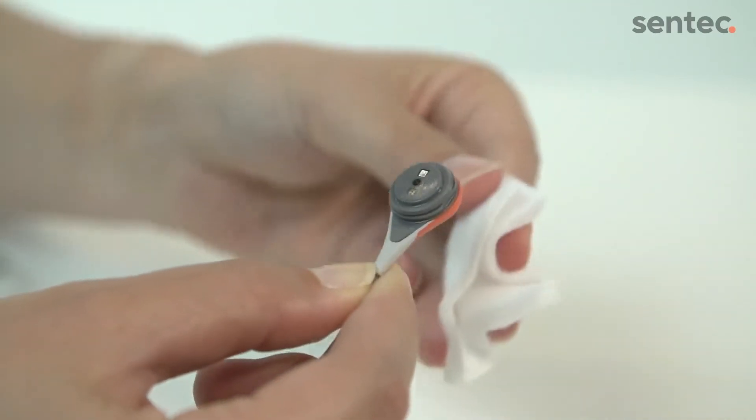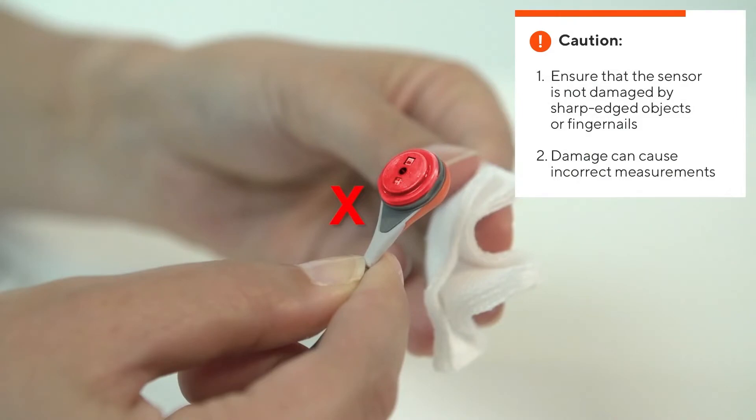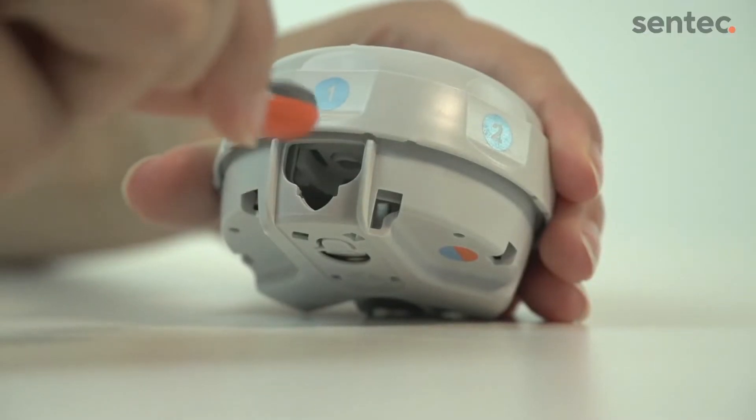Gently tap the gauze on the sensor surface to dry. Do not rub the sensor surface. Once the sensor is dry, you will need to replace the membrane.